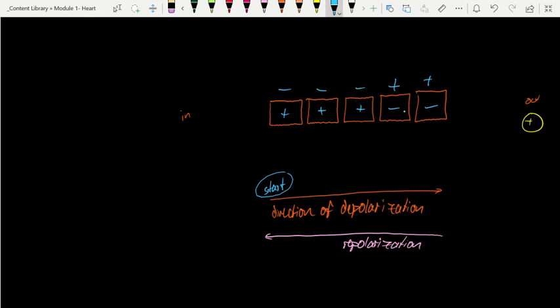Now, it's actually not uncommon to find people that have an inverted T wave, but more often than not, that's diagnostic for something like ischemia, where following a heart attack or something, that part of the heart is damaged and these cells are out of sync, and so the timing of the cells becomes equal. And if the timing of each cell is equal, then the direction of depolarization would be the same as the direction of repolarization, and we would see an inverted T wave or a negatively deflected T wave.